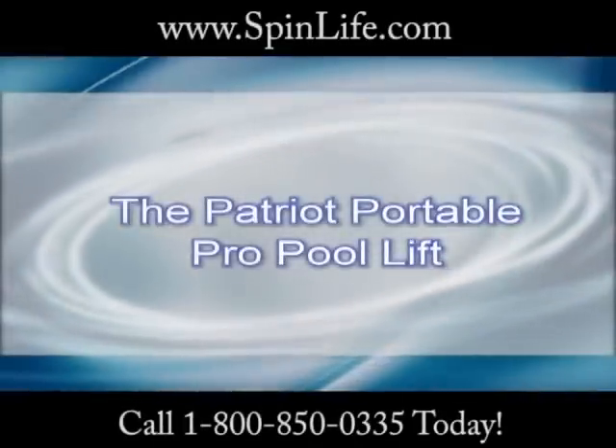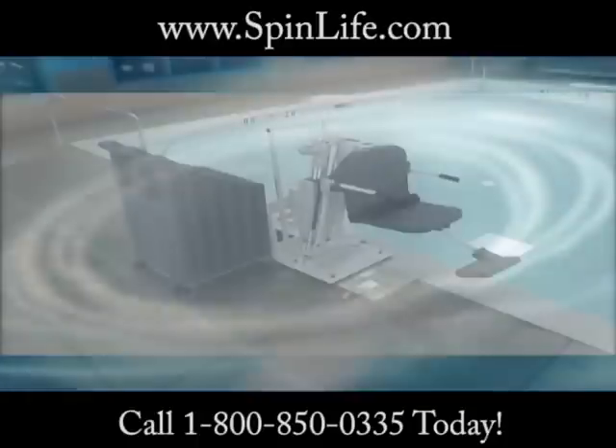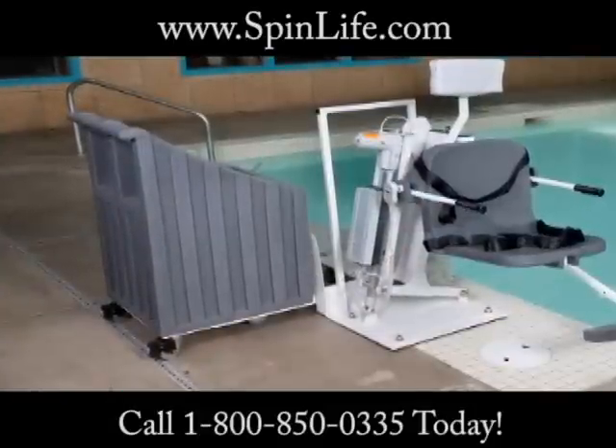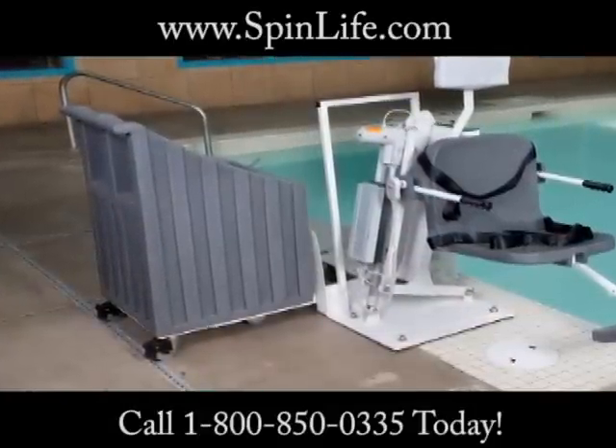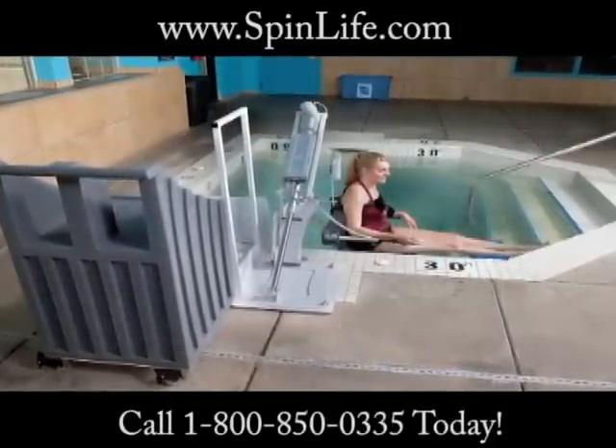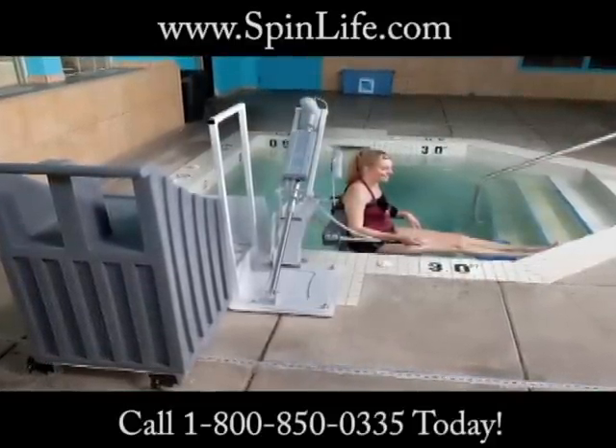Introducing the Patriot Portable Pro Pool Lift. The Patriot Lift incorporates our most popular lift, the Pro Pool Lift, with a newly designed cart that provides for complete portability of the lift, all while meeting the federal ADA accessibility guidelines, making this lift ideal for commercial facilities.